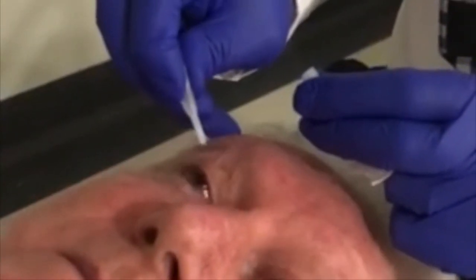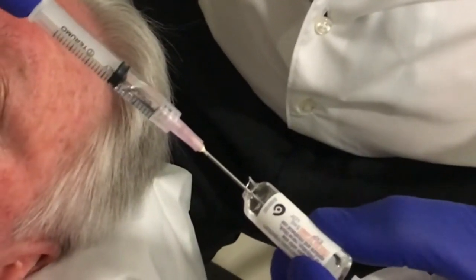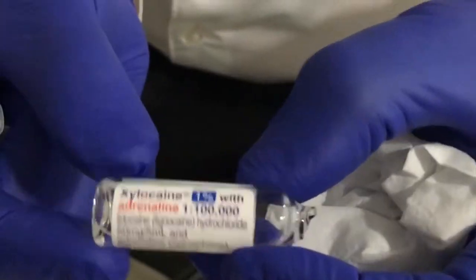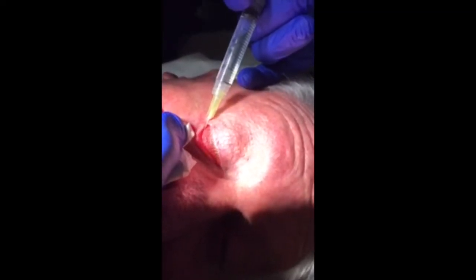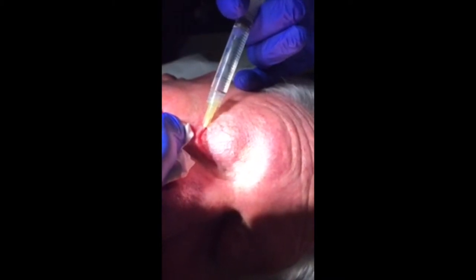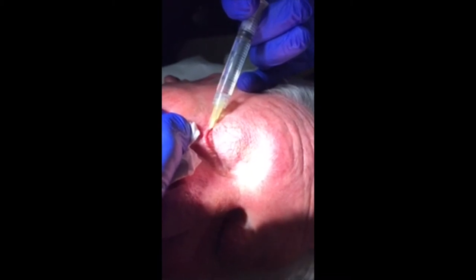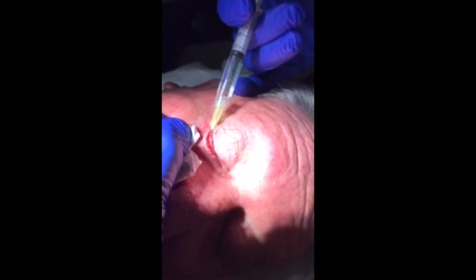Install a drop of local anaesthetic into the eye, then draw up local anaesthetic ready for injection into the eyelid. Inject local anaesthetic into the eyelid to be treated. While most patients do not require additional pain relief following the Permablate electrolysis treatment, it should be made available to them.